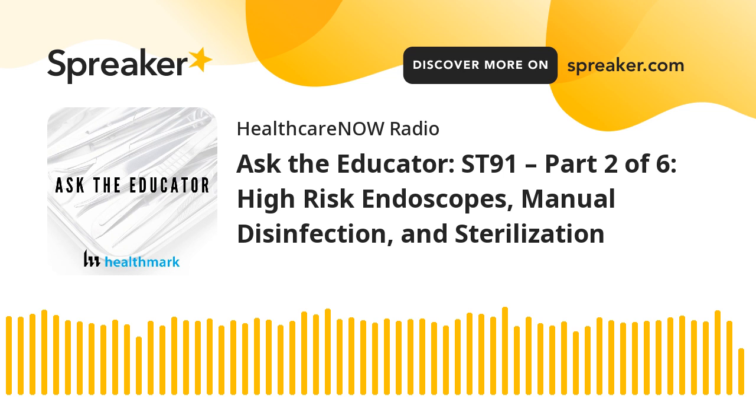So if it says a shall, and you're saying you comply with that standard, then that's something your facility has to do. So we say every high-risk endoscope shall have a cleaning verification test on it every time it's processed. So that's every high-risk scope every time.